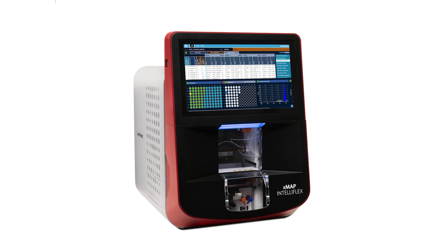This new software version includes several bug fixes and feature updates that will enhance your user experience. In addition to these updates, we are offering two additional software licenses for purchase, enabling even more capabilities for your XMAP IntelliFlex System.